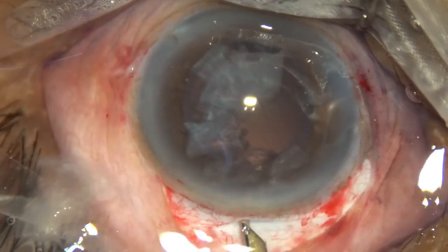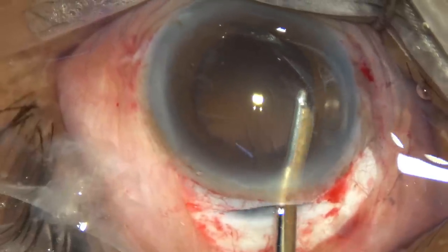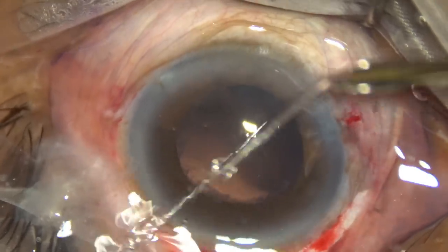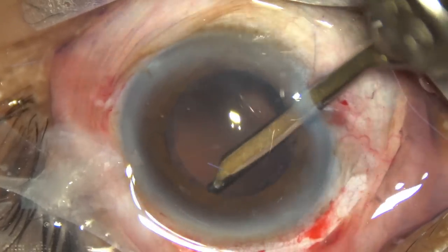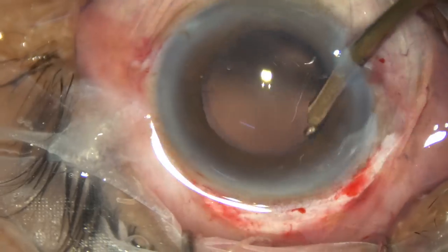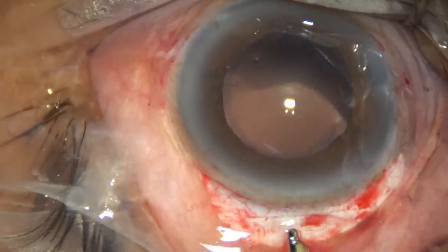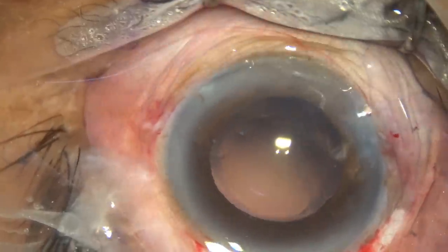The soft cortex is removed. And now I go through the side port and remove the cortex from all around. Nice cleaning of cortex.